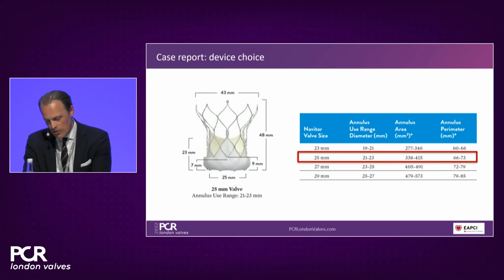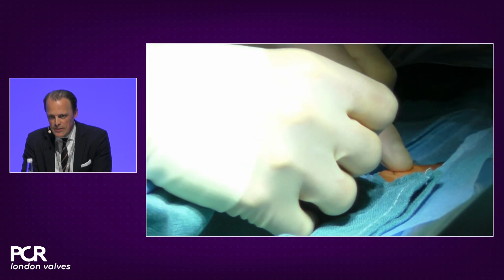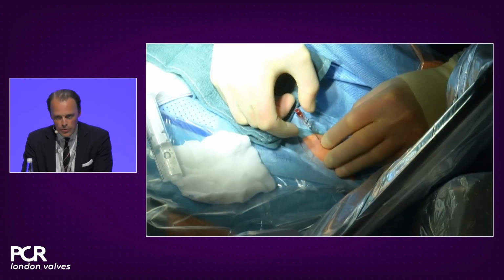This is just to show we did pick a TAVR according to everything that has been discussed. This fell right into place for a 25 valve Navitor, and this is the case we did. Awake, of course, local anesthesia only.